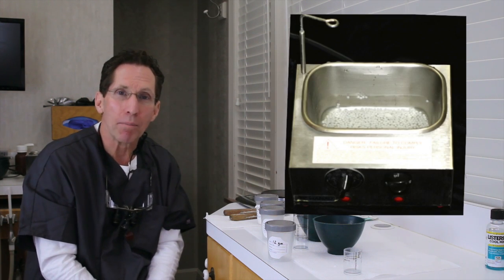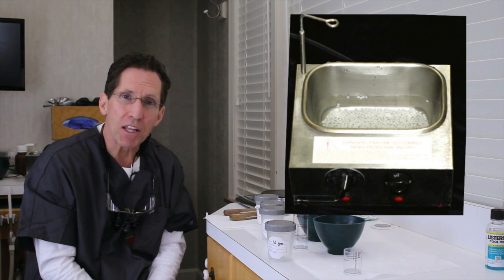Now, what we use is we have one of those old Hanau water baths, and we have it set at 30 degrees Celsius, which is about 87 degrees Fahrenheit. And we found that that temperature with these water powder ratios gives us a very nice working time. It gives us enough time to get in and do what we need to do, and you'll not be waiting and waiting and waiting either.